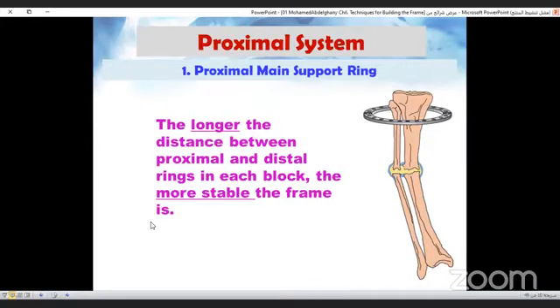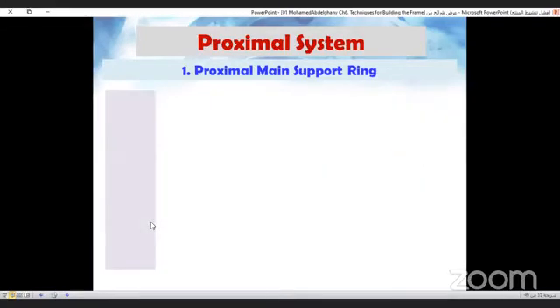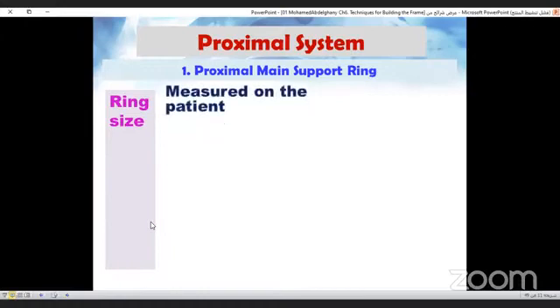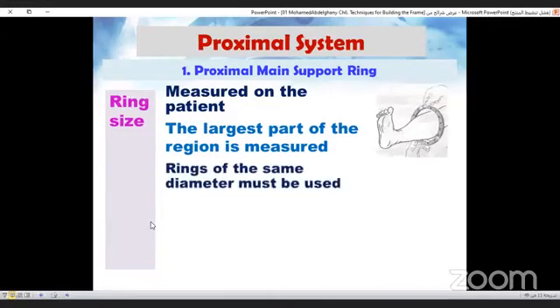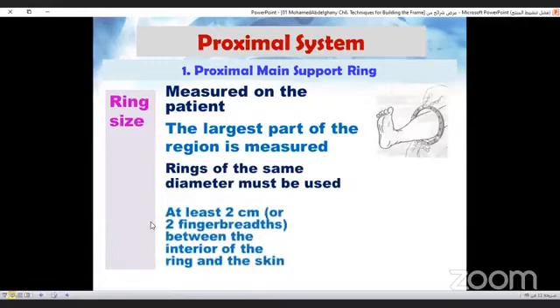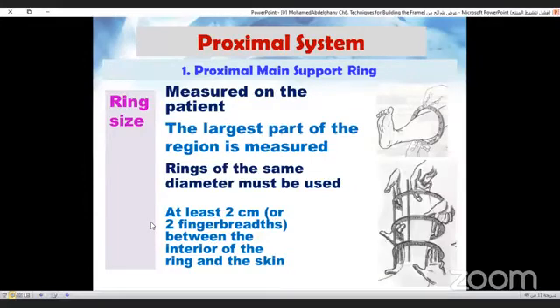The longer the distance between the proximal and distal rings in each block, the more stable the frame is. Now, how to measure the ring size. The ring is measured on the patient. We measure the largest portion of the region and we must use rings of the same size. At least two finger breadth of space should be left between the interior of the ring and the skin.